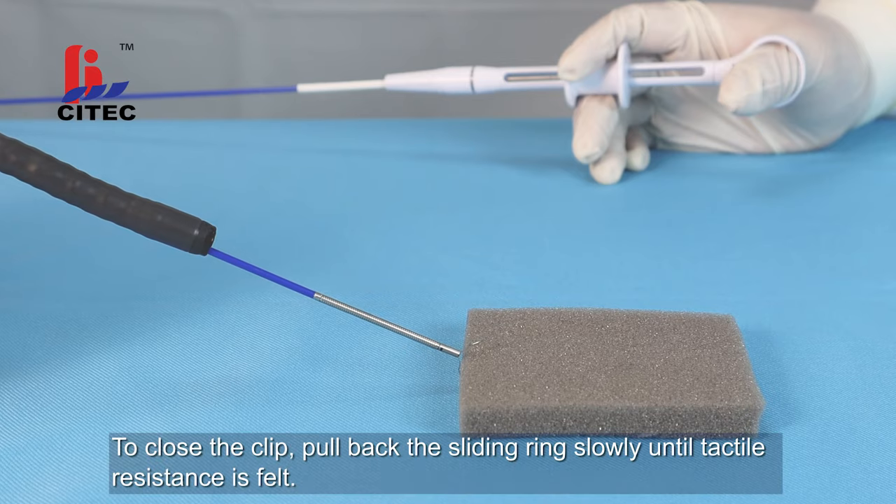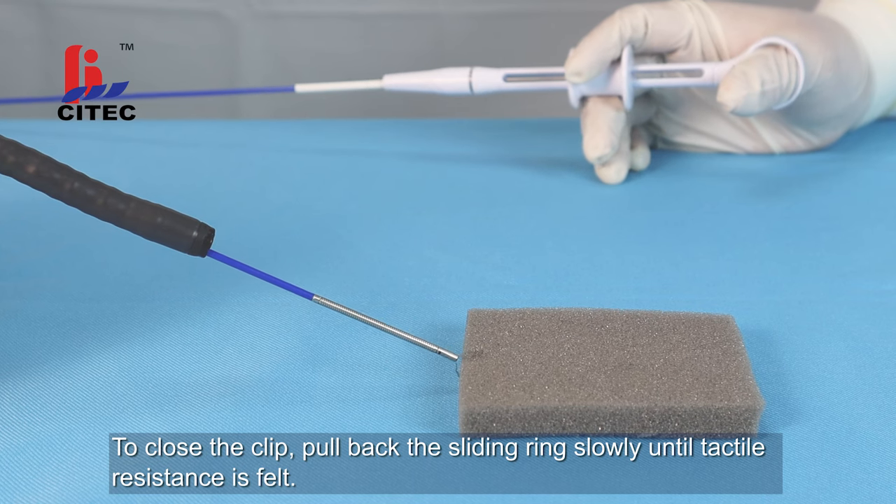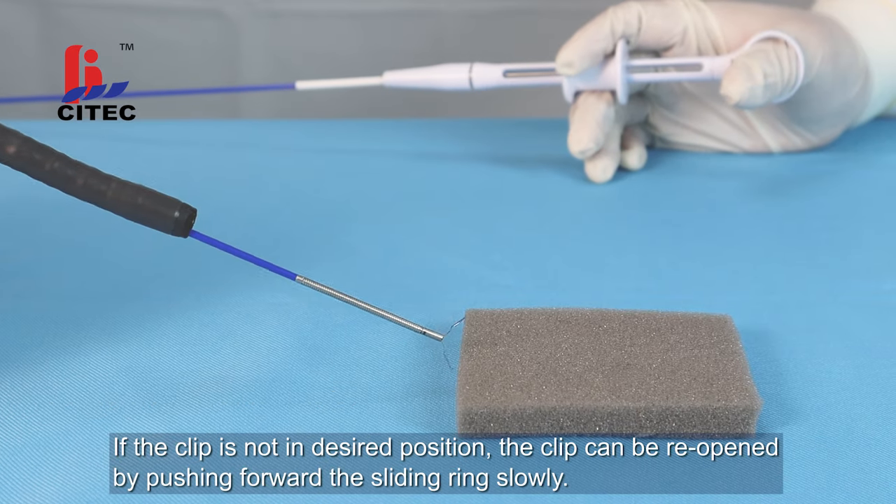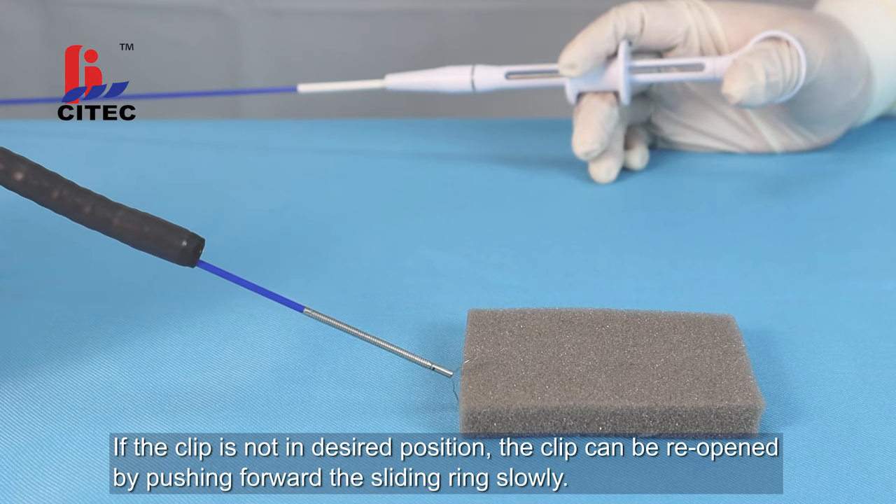To close the clip, pull back the sliding ring slowly until tactile resistance is felt. Do not pull the sliding ring beyond the tactile resistance point unless the clip is ready to deploy. If the clip is not in the desired position, the clip can be reopened by pushing forward the sliding ring slowly.